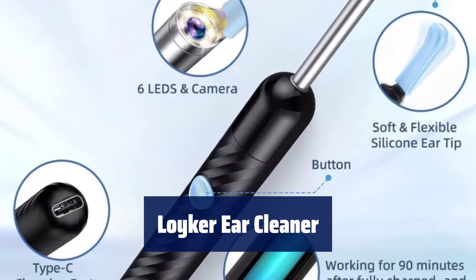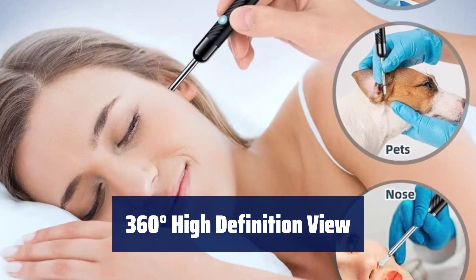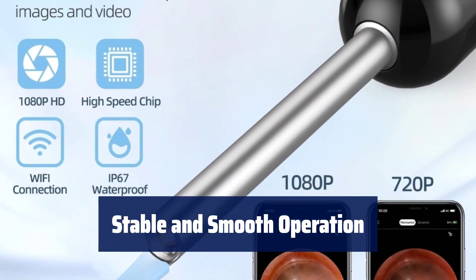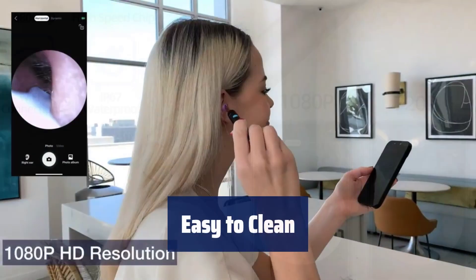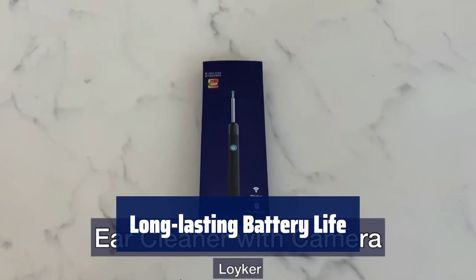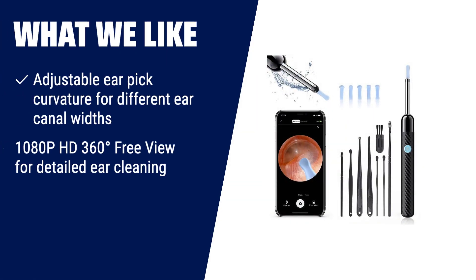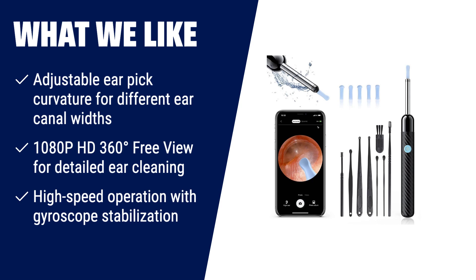Number 2: The ear cleaner adjusts to fit your ear canal, making it comfortable for everyone. The wide-angle lens captures clear pictures and videos without any blind spots. The gyroscope stabilizes images for precise cleaning without any damage. The waterproof lens can be easily cleaned with water or alcohol wipes. With fast charging, it provides 90 minutes of continuous use. What we like: Say goodbye to earwax troubles with this Earwax Removal Kit. Its adjustable earpick curvature and soft silicone ear spoon cover ensure a comfortable and effective cleaning experience. The 1080p HD 360-degree free-view camera captures high-definition pictures and videos, while the gyroscope stabilization ensures smooth and precise cleaning.